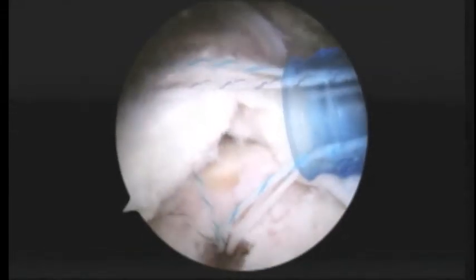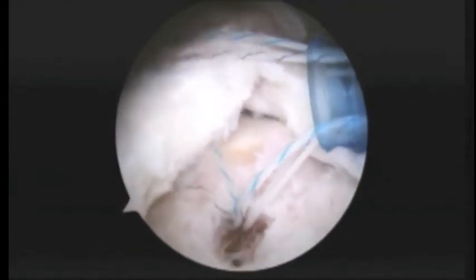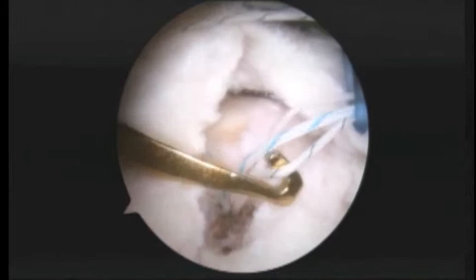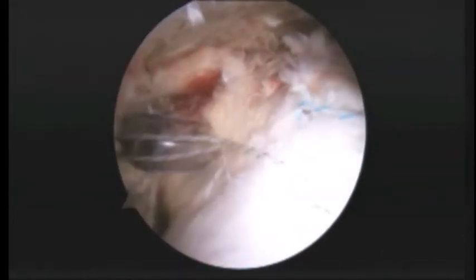Okay, so what we're doing here is taking all the sutures out the anterior cannula like that, so that we can now tie them one at a time from posterior. And as you recall, the black and white suture was the first one that we worked with, so we'll grab that first. Just like that. And we'll go ahead and start tying these sutures one at a time. We'll show you this first one here.